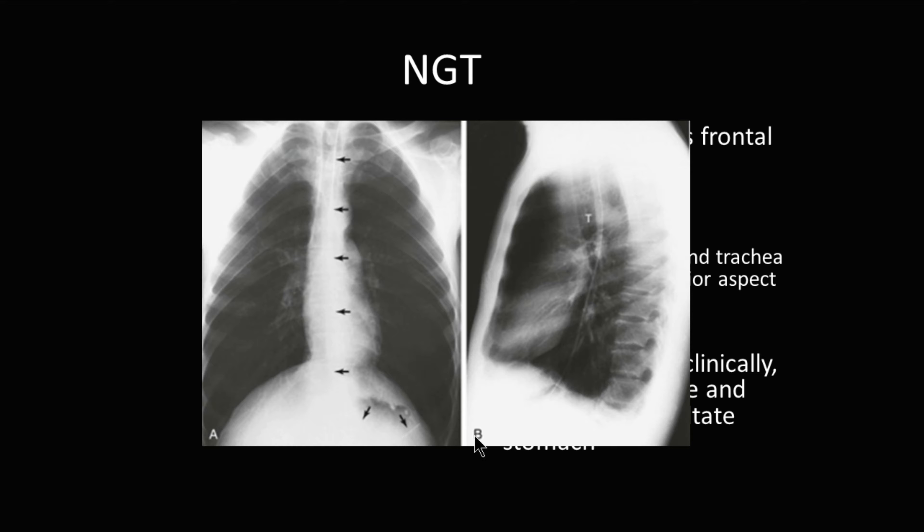If there is doubt, you can do a lateral chest x-ray. You can see that this NG tube is going down the esophagus. This is the trachea here. Coming down the esophagus, it crosses the lower esophageal sphincter and enters into the stomach. This is a well-placed NG tube.